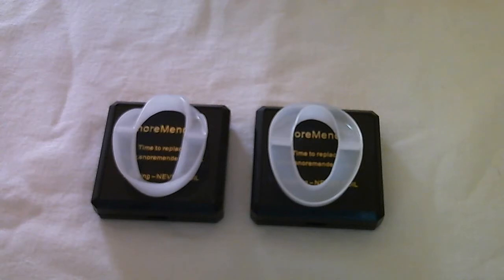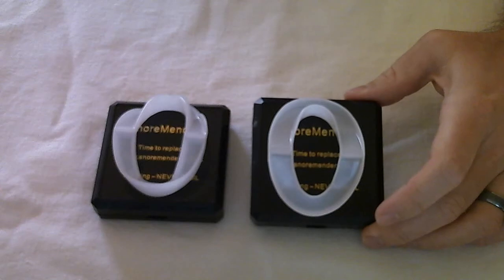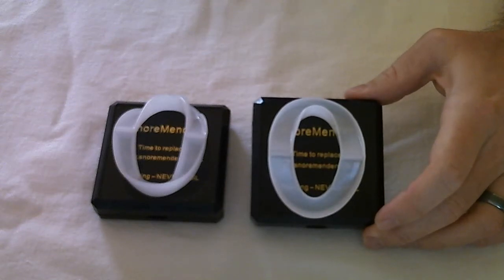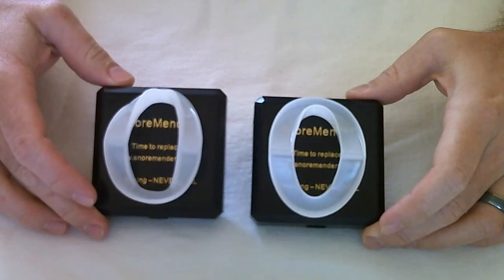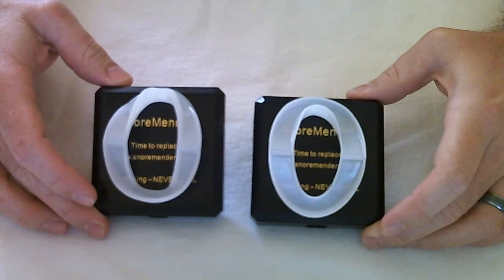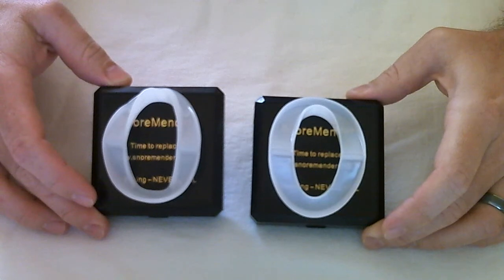You'll notice a difference in the overall design when you compare the two. With the original, the walls are pretty much consistent as far as the thickness all the way around from front to back. With the newer design, it's a bit thicker in the rear and it gets thinner towards the front, and this more closely fits around the contour of your teeth. There's also a bit less material used in the newer product. Some unnecessary parts were actually removed.